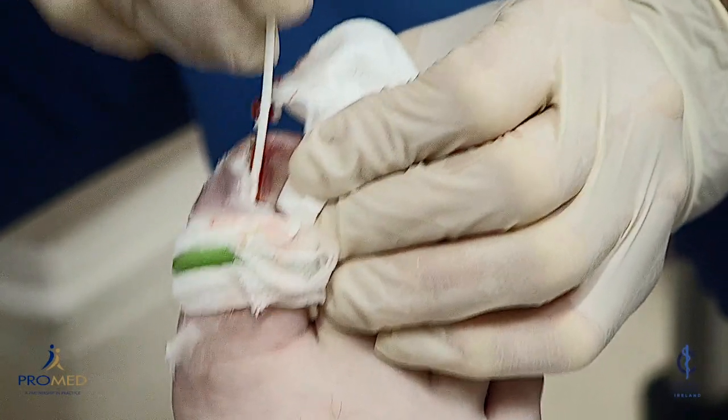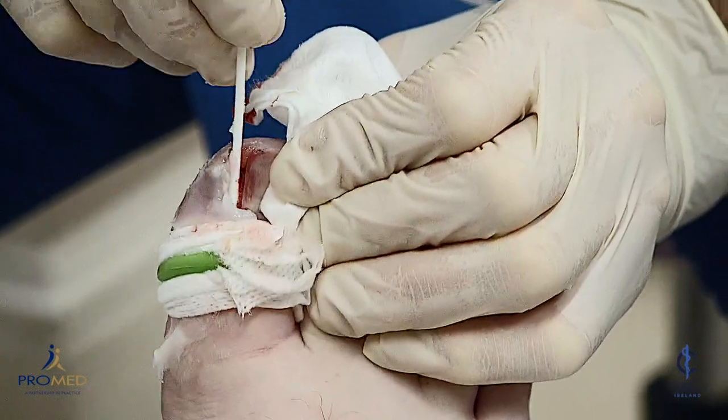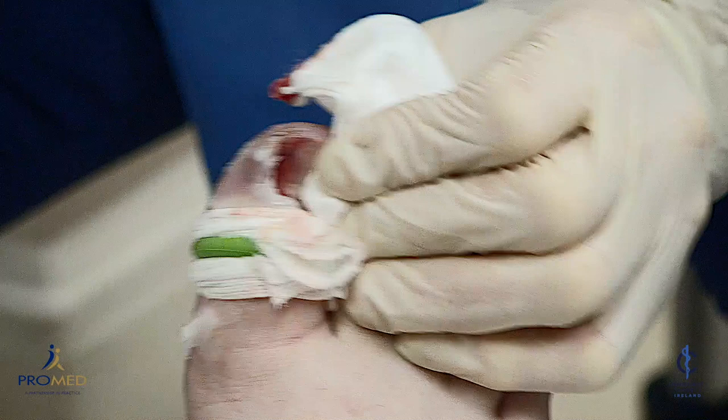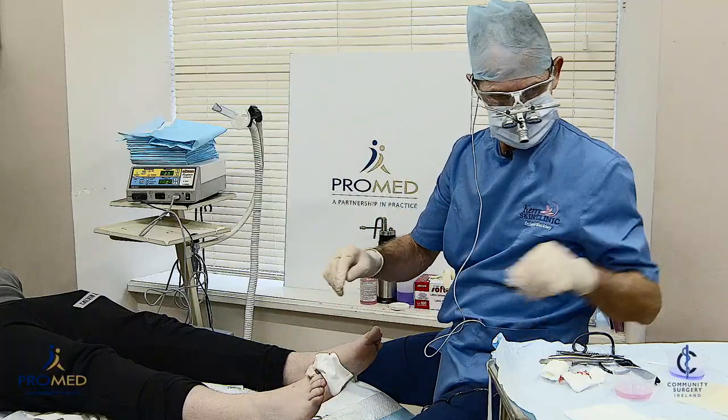After one minute you can do the other side. You should probably use a fresh swab. That's a minute — but what we're going to do is use radiosurgery instead of phenol.